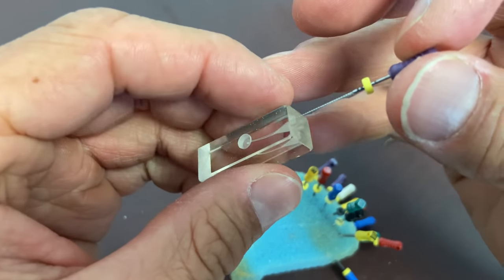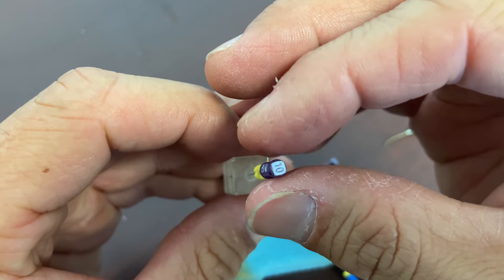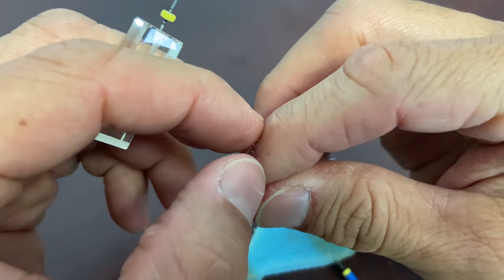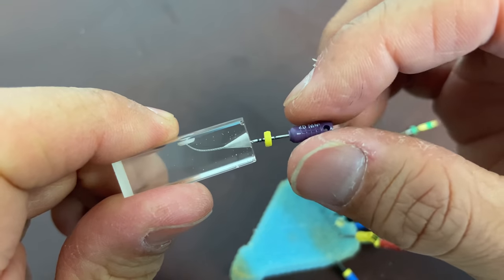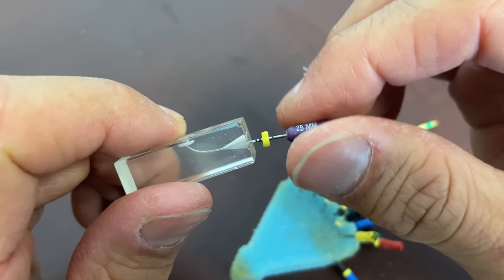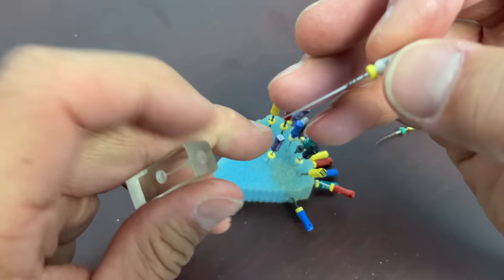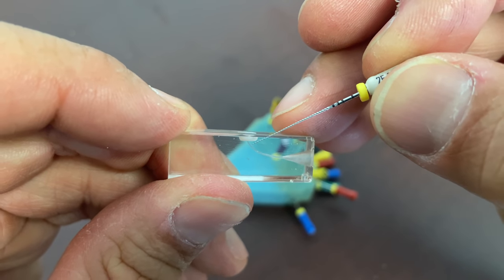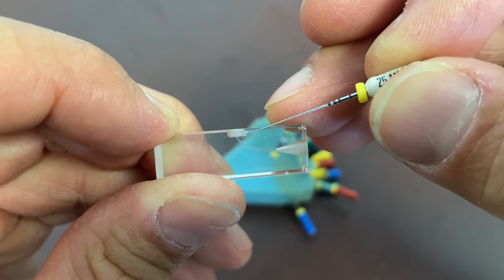Let's get back to the first standard type of filing. These canals are set for about a 15 file. Everyone knows watch winding — it's about 30 degrees back and forth. What I've noticed with new grads is that they hold the file really meaty. It's important to have just a nice light tactile hold. You can see the canal already has a decent curve on it — maybe 45 degrees.